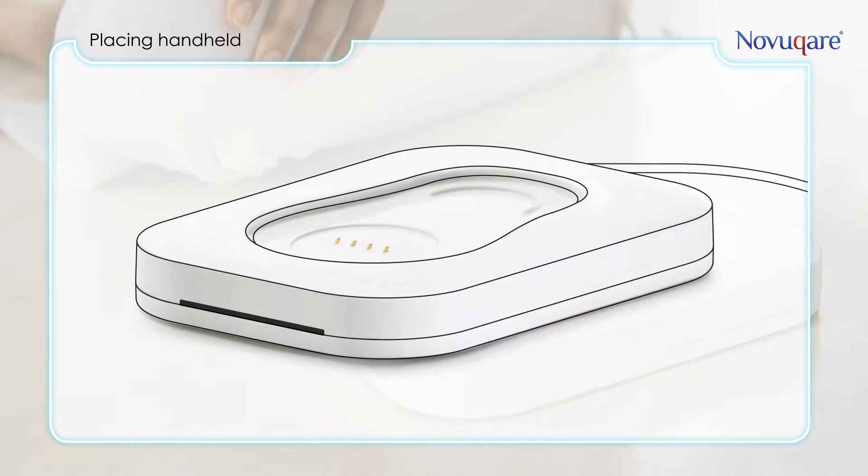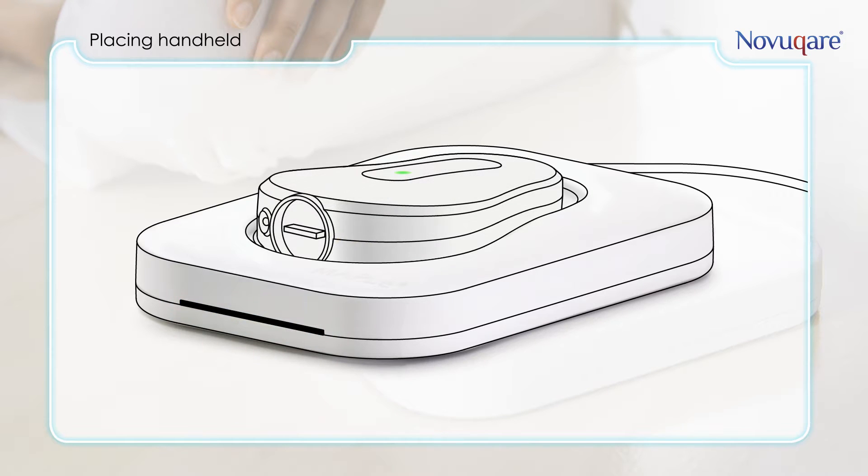If you place the handheld on the docking station, the docking station will blink blue, indicating that the handheld is charging. If the handheld is still on, it will shut off automatically before starting to charge. Also, be sure to disconnect all cables from the handheld before charging. If the handheld is fully charged, the docking station will stay blue.